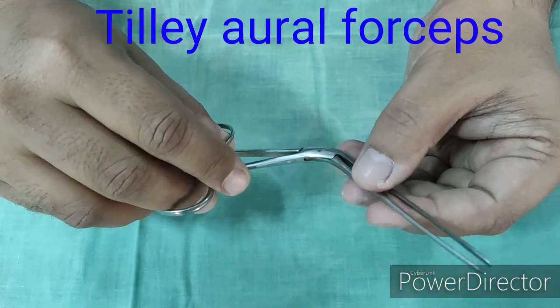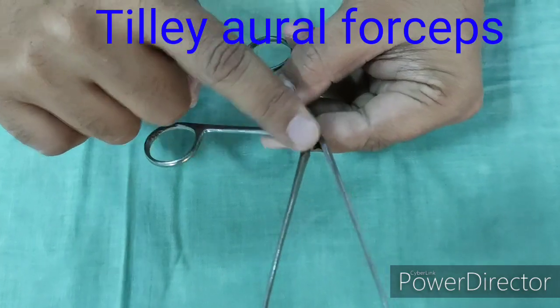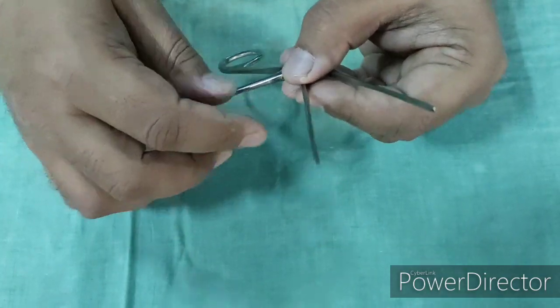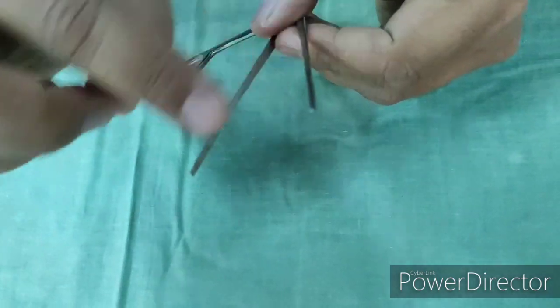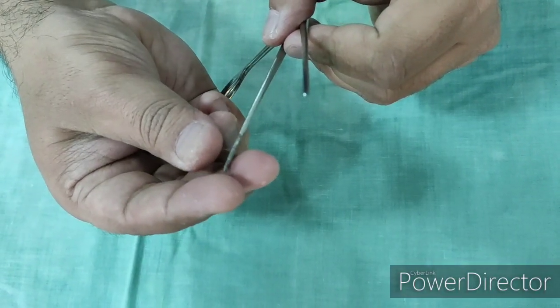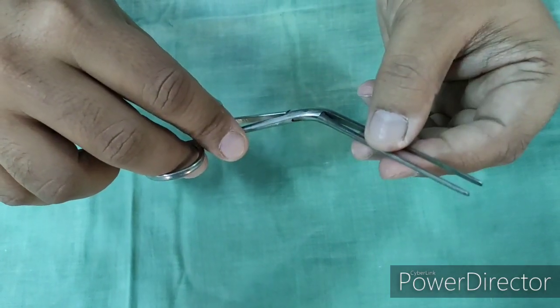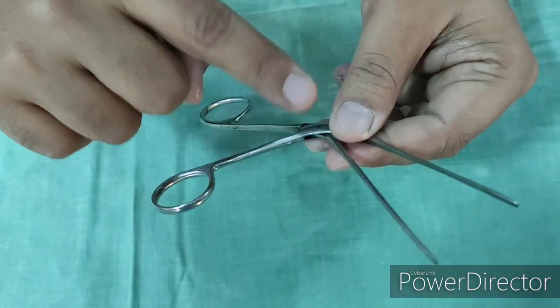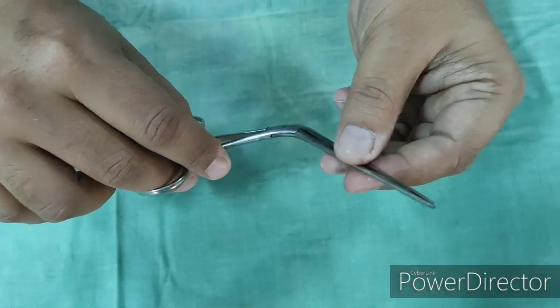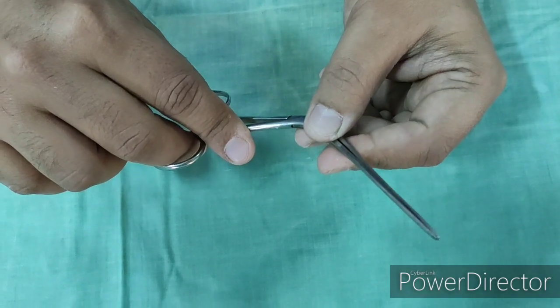This is Tilly's Aural Forcep. There are two types of aural forcep — one is Tilly's and another one is Hartman's. Hartman's has a screw joint; Tilly's has a box joint. To remember: 'screw the Hartman's.' Another difference is that only the tip of the blades is serrated in Tilly's forcep, while in Hartman's the distal end is a bit spade-like. The use of this forcep is to instill medicated wicks into the ear canal, to clean the ear, and to pack and unpack the nose — sometimes it is called Tilly's nasal dressing forcep. It is used, for example, in otitis externa to keep a medicated wick in the canal, and also to remove foreign bodies from the ear and occasionally from the nose.